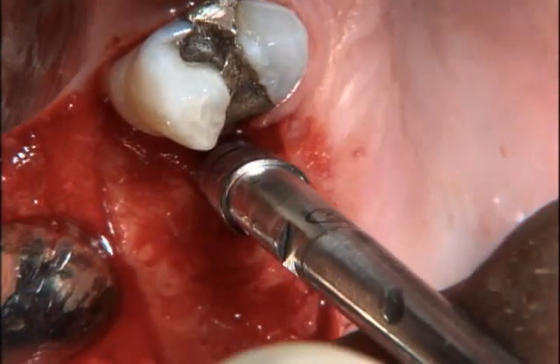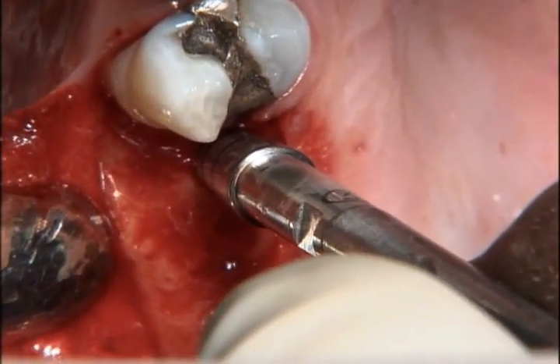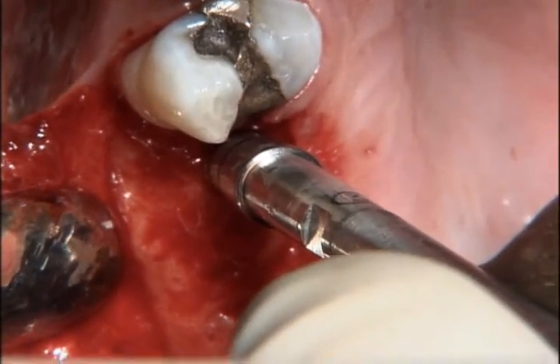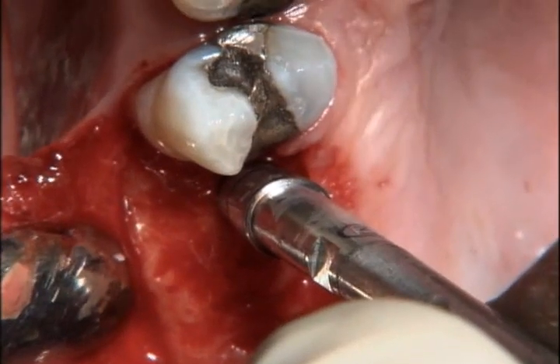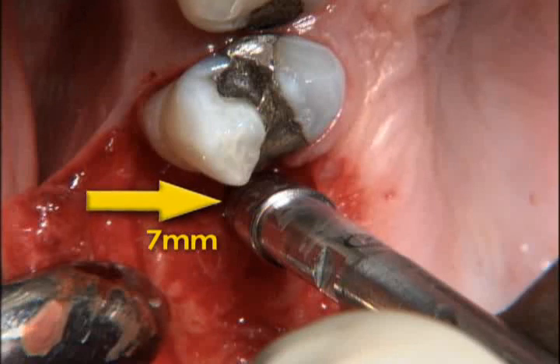As no graft particles were needed to help with stabilization at the apex of this first implant, the number 3 osteotome tip was then tapped to the full depth of 7 millimeters needed to receive the implant. The plug of autogenous bone, automatically compacted and collected apically by the advancing osteotome tips, was considered sufficient to elevate the Schneiderian membrane at this site.